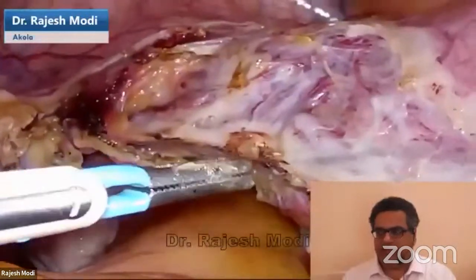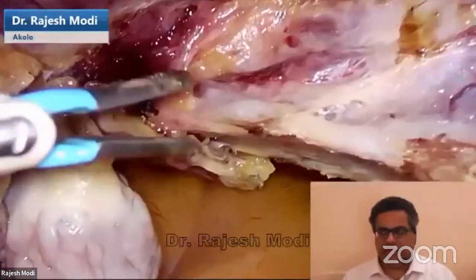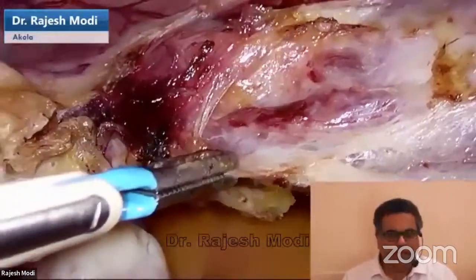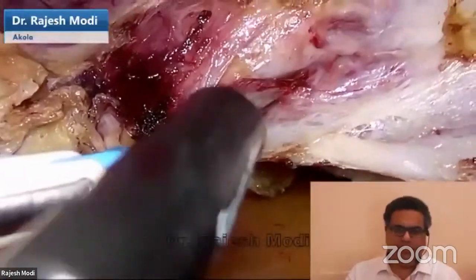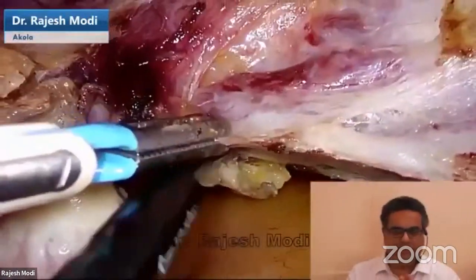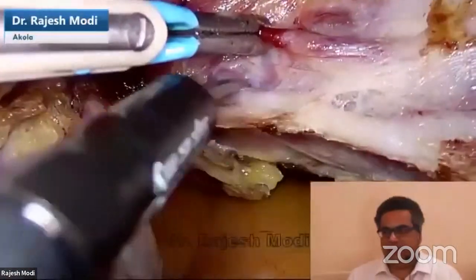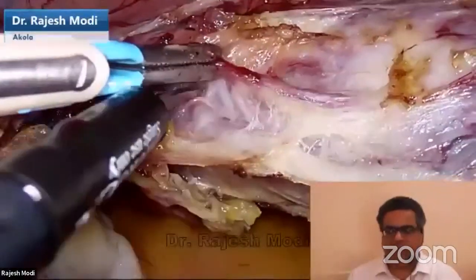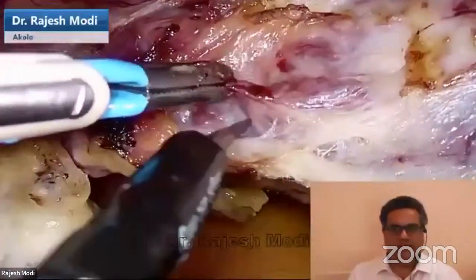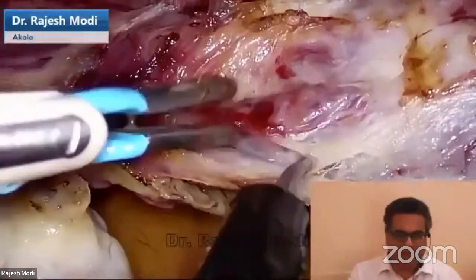So here you can see right from the level of the knuckle, which is at the ascending part, to the transverse part, the entire uterine vessel is skeletonized. You probably need about 20 surgeries or 20 TLH where you have done this dissection with an effort to become comfortable with the whole concept. This subsequent dissection is just for the sake of highlighting that you can go ahead, but skeletonizing the uterine artery away from the vein is absolutely not required.